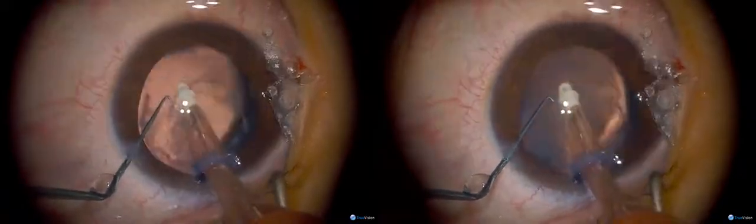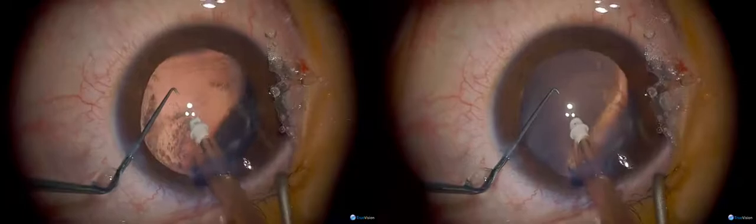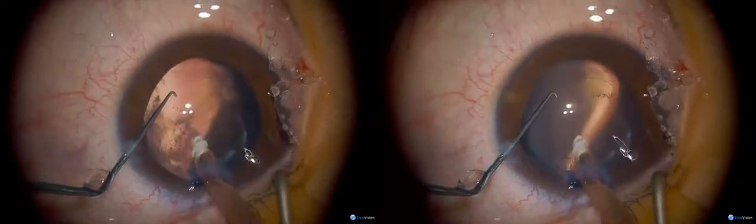So I think what I'm going to do is put a lens in the eye now — 24.5, MA60AC.